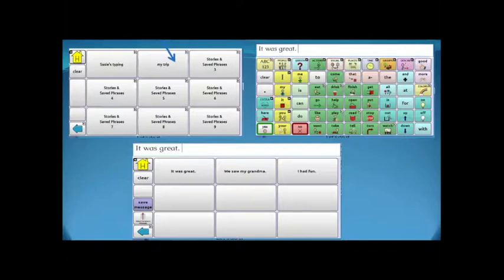Okay, so that's the stories and scripts. One thing I really like about this is if somebody has to do a report in class, you can plan it all beforehand and then they can talk in sentences. So it's not like they have to do this great big scrolling without taking a breath type of talking.